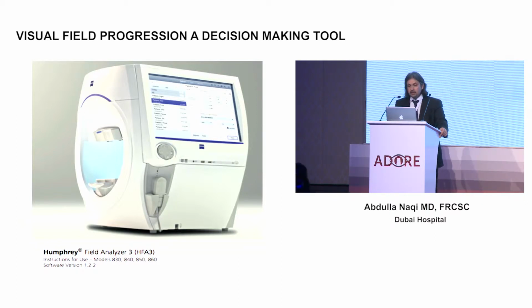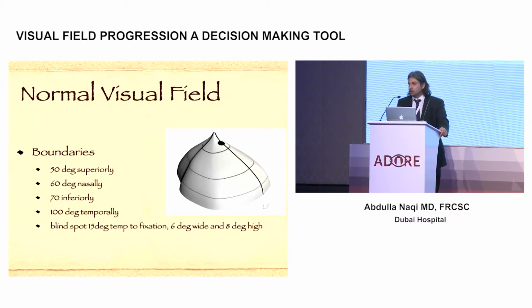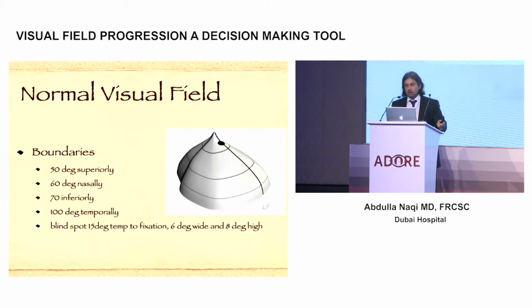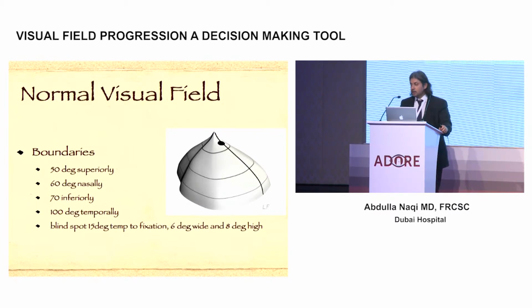But automated visual field analysis nowadays is one of the gold standards in treatment and management of glaucoma patients. Vision has been described as an island of vision in a sea of blindness. And this island of vision has boundaries: nasal, superior, temporal, and inferior. It peaks at the macula, and it has a blind spot.